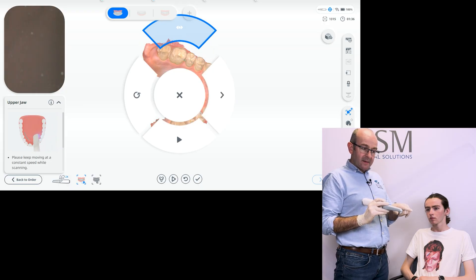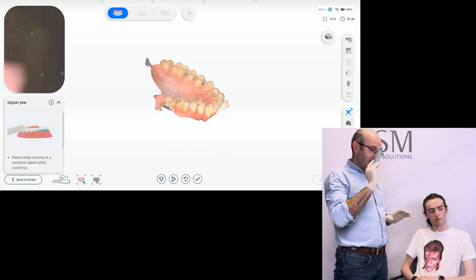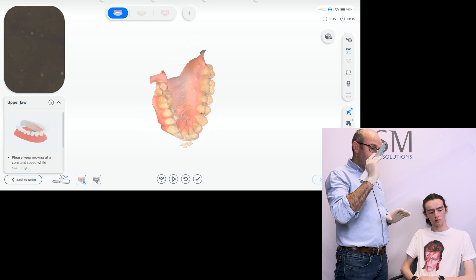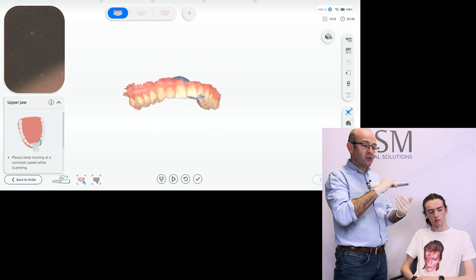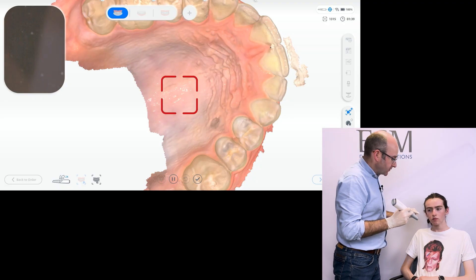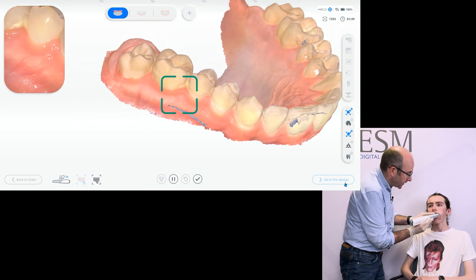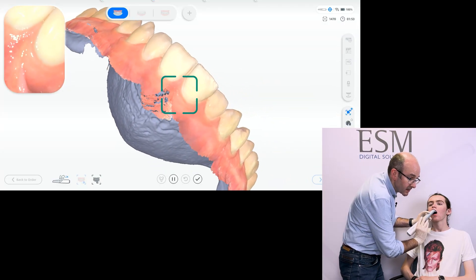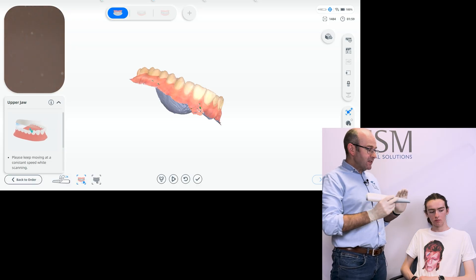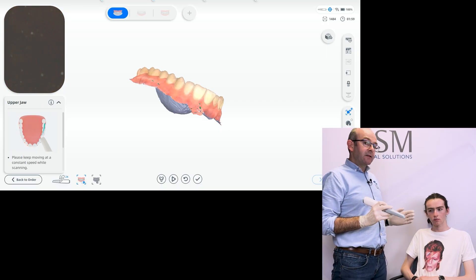We've got a great scan — we can verify that by rotating it on screen. Double-click the scanner, tip it up to select view mode until that little option goes solid blue, and then we can use the scanner to rotate the image. Reviewing it: the distal on the upper-left seven could use a bit more buccal-distal detail, and around the incisors I captured some glove — the AI function thought that might be tooth surface. So we go back in to get a little more gingiva and rescan that incisor area. As I rescanned, the software recaptured the incisor and the AI functionality removed the finger artifact. We're finished with the upper arch and really happy with everything.